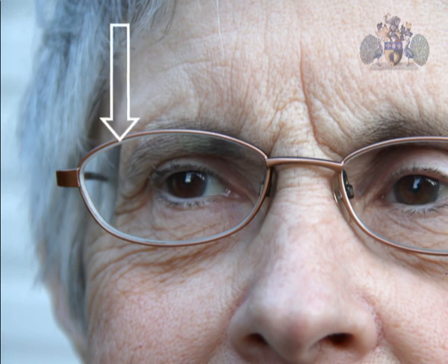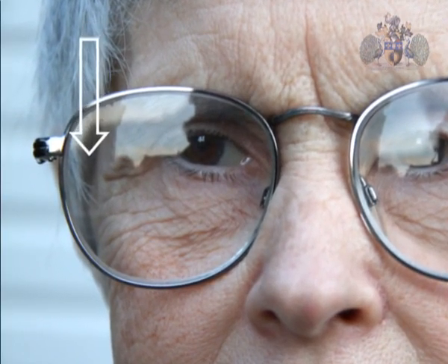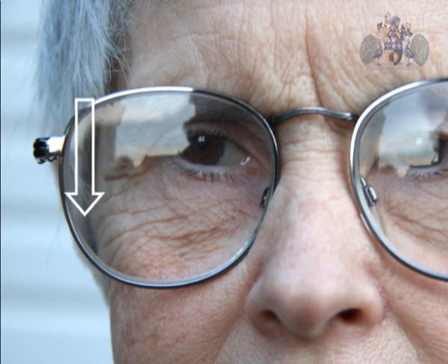If one looks at a patient's face when they are wearing their spectacle correction, if they are wearing a myopic spectacle correction, the edges of the skull adjacent to the lateral canthus will appear drawn in. The opposite of this is apparent with hypermetropic spectacles, where the edges of the skull adjacent to the lateral canthus appear to bulge out when the examiner is looking at this through the patient's own spectacles. The higher the refractive error, the more noticeable the aberration.